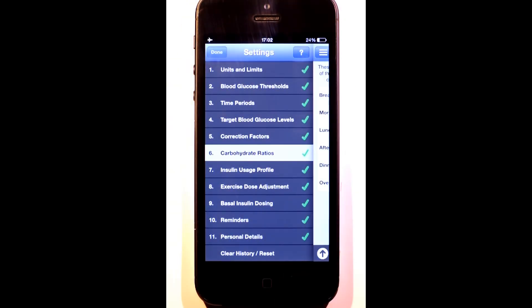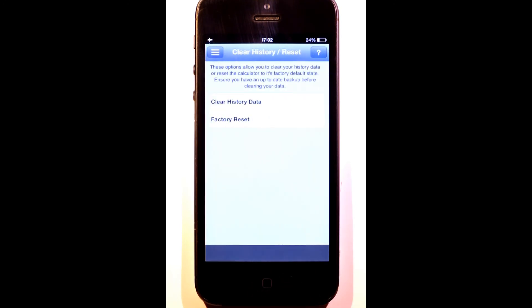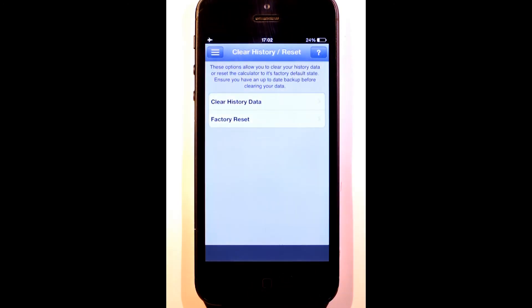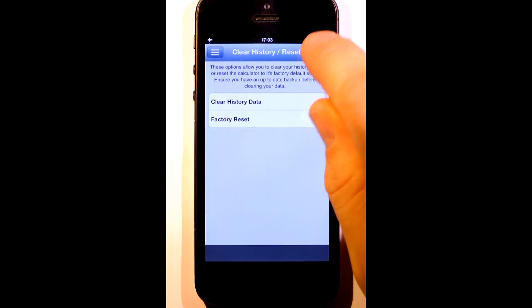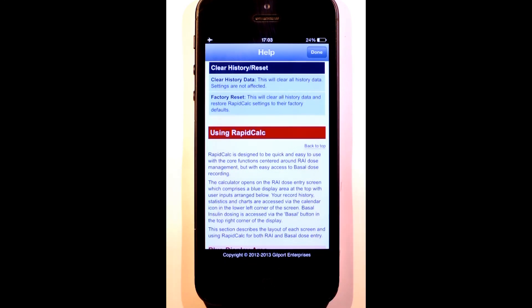If I need to clear my data or factory reset RapidCalc, I can do that here. Of course, all sections have context-sensitive help.